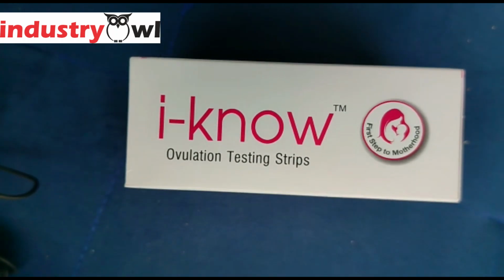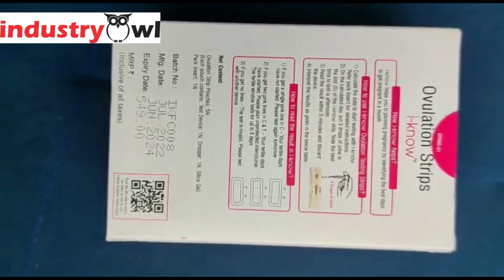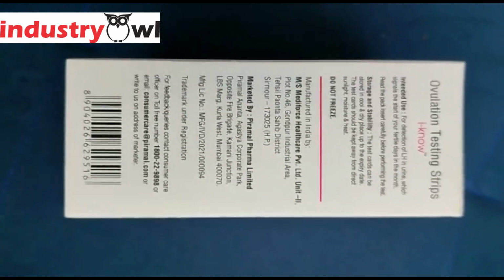So let's start with how iKnow helps. iKnow helps you in planning pregnancy by identifying the best dates to get pregnant in a month.